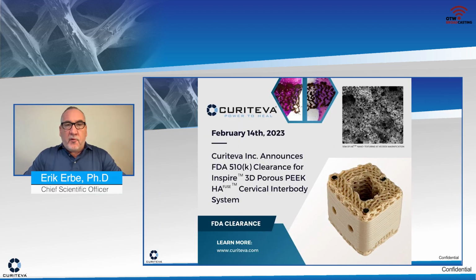Thank you, Robin, for that wonderful introduction. I am indeed honored and privileged to be representing this conversation with this illustrious faculty. But before we get into the conversation, I'd like to begin by echoing your sentiments, Robin, about this being truly a revolutionary technology, an enabling technology that's not achieved and hasn't been achieved any other way. The 3D printing of a PEEK trabecular lattice, to me, is a culmination of decades of work. There's a lot of effort, myself included, going back several decades, looking at trying to make PEEK bioactive to overcome its Achilles heel of creating fibrous tissue because of its hydrophobicity, despite some of its wonderful properties.